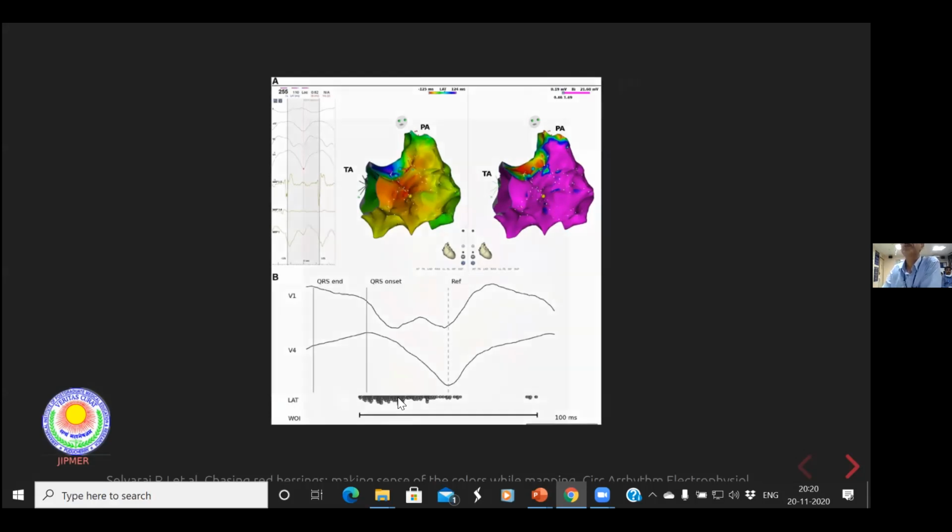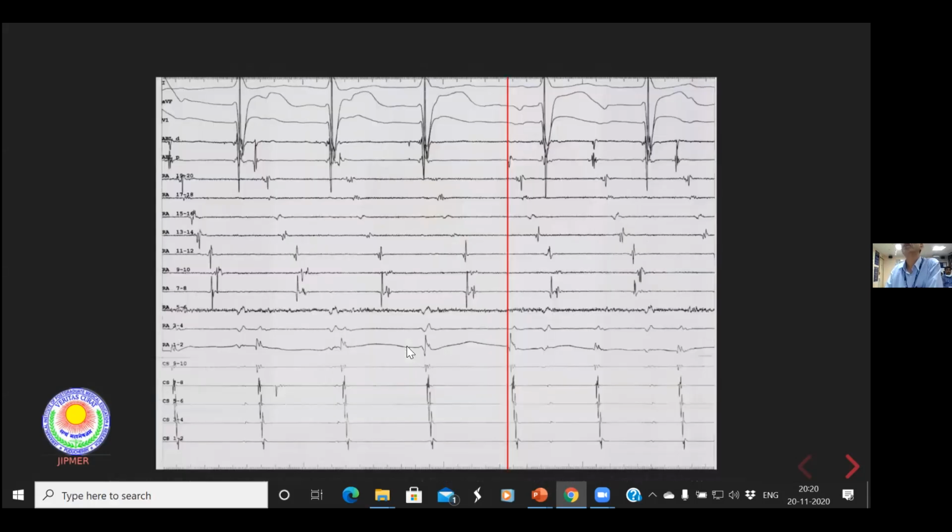So whenever you choose windows for re-entry, it actually doesn't make a difference how you choose, as long as we pick 95 to 100% of the cycle length for re-entry. We know about DePonte's method, where you can try to place your window onset right between two P waves, but it really doesn't matter how you set it.